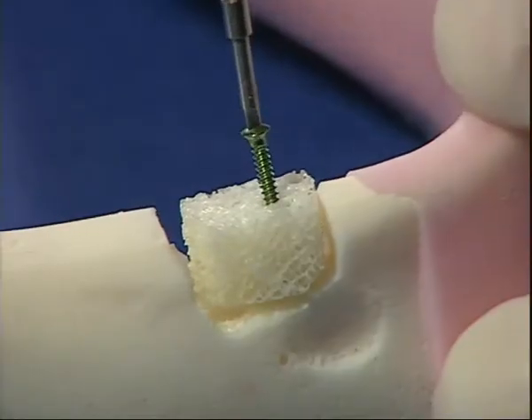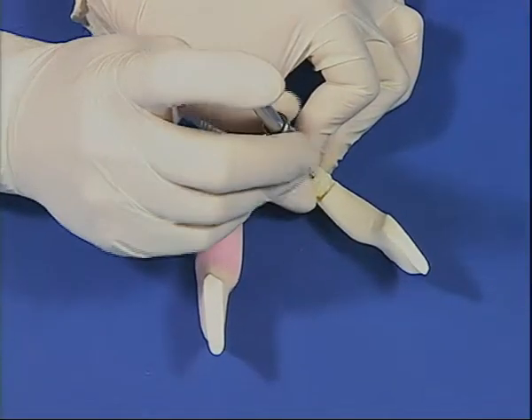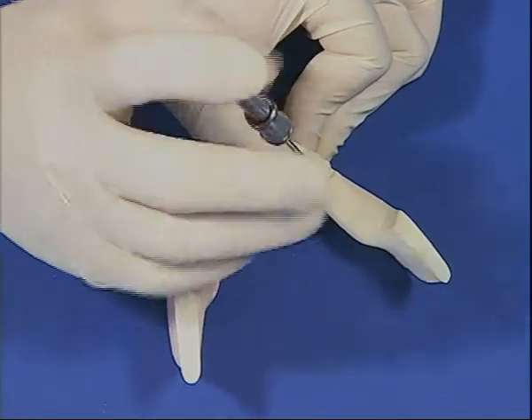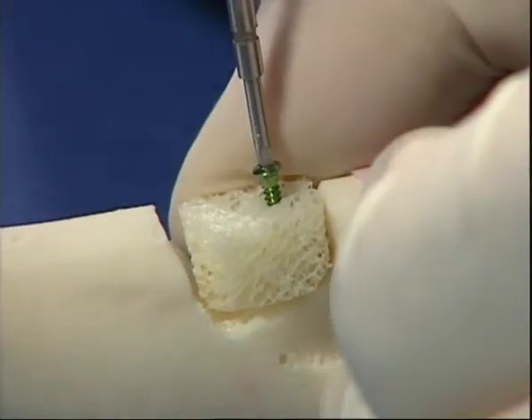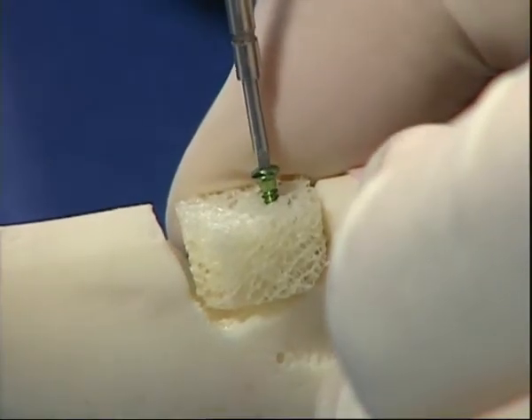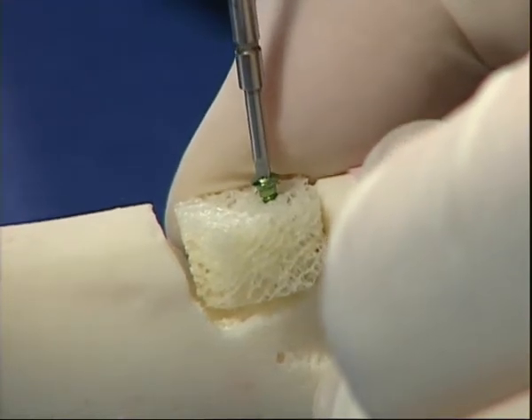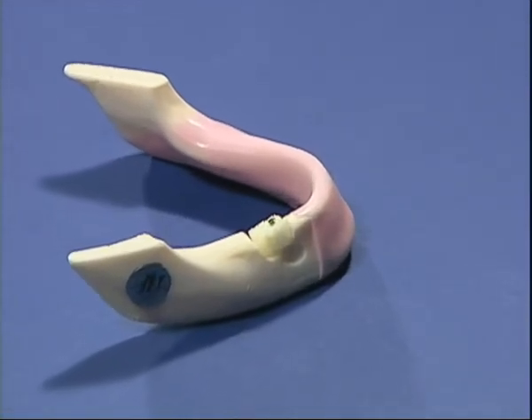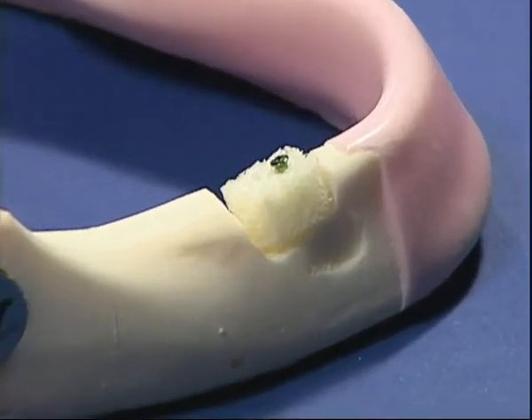This is the type of screw you use to fix the graft. Regeneration requires primary stability, just like a titanium implant. Looseness causes an inflammatory process to arise, which leads to the production of fibrous tissue. In this case, the fibrous tissue performs as a screen, a barrier against the invasion of the vessels, that is, to angiogenesis, and this has to be carefully avoided.